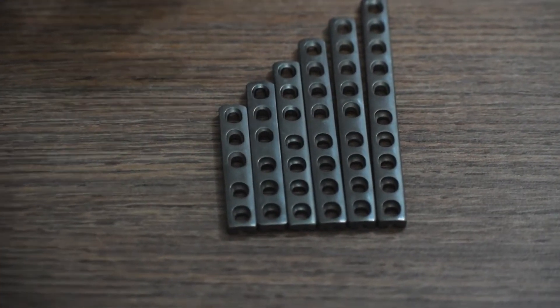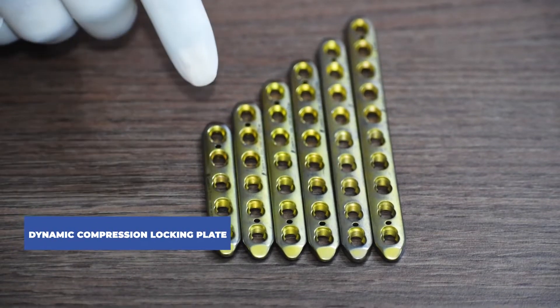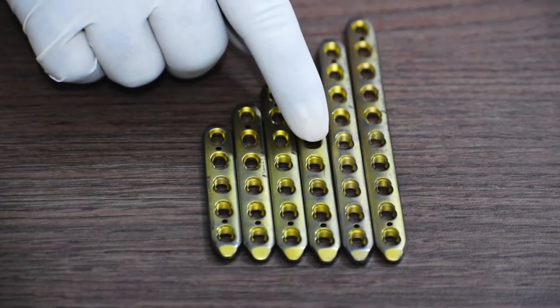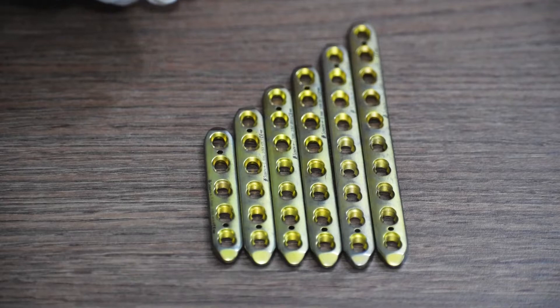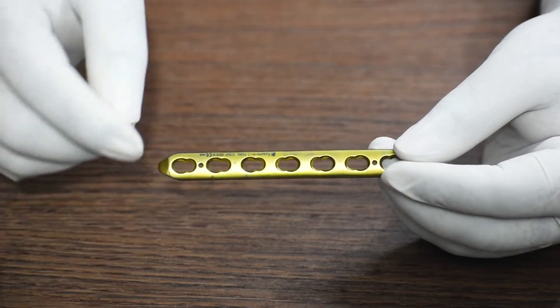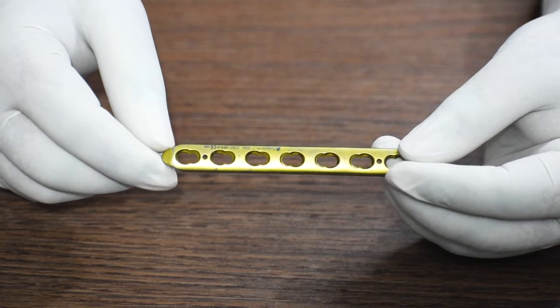They come in two sets. This is the dynamic compression locking plate, again available from five hole to ten hole — five, six, seven, eight, nine, and ten holes, with one hole gap in between each plate. This also comes in two sets. For the locking plates, it comes with a combi hole, meaning it has both the option of a non-locking hole and a locking hole, so you can fix it with either a cortical screw or a locking screw.